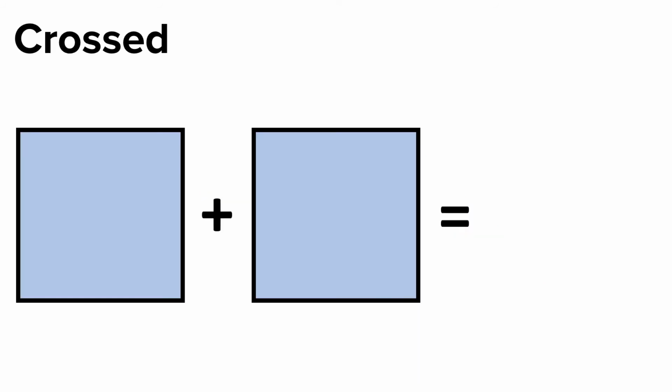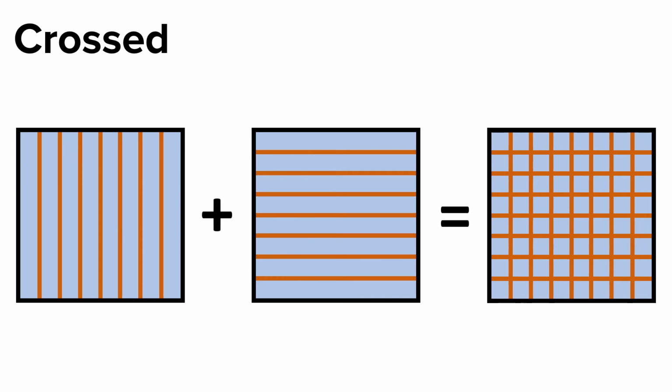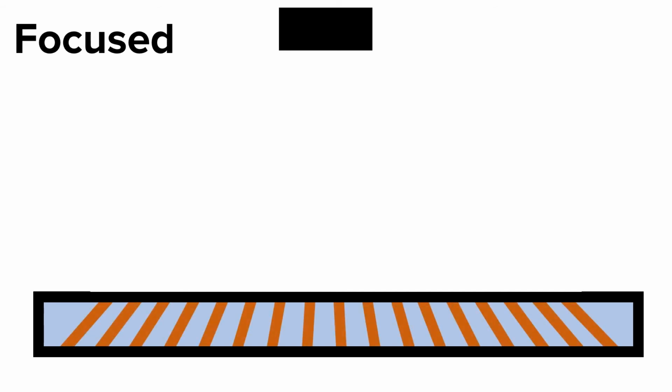You can see on this image that only the primary beam closest to the central ray is making it through the grid. A crossed grid will have two parallel grids stacked on top of each other to form a matrix. The main advantages with a crossed grid are that they are cheap to produce and they're better than a parallel grid. For example, a 6:1 crossed grid is better than a 12:1 parallel grid. The three disadvantages of a crossed grid are that positioning is critical, you'll need a substantially higher technique, and you still get grid cutoff.